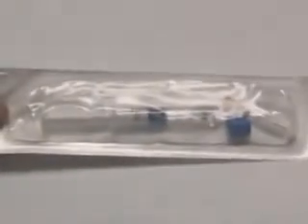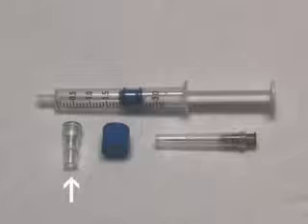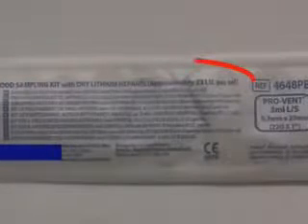Standard arterial blood gas sampling kits are readily available that contain a syringe, a small 23 to 25 gauge needle either with a rubber stopper that may be used to remove the needle from the syringe or with an attached safety cap, and a syringe cap containing dry lithium heparin or sodium heparin. The concentration of heparin here varies depending on the manufacturer of the kit.